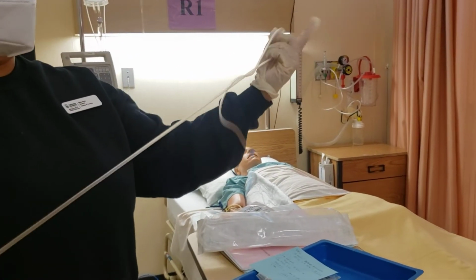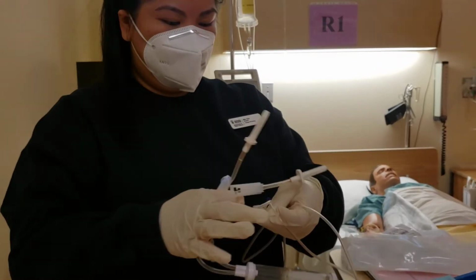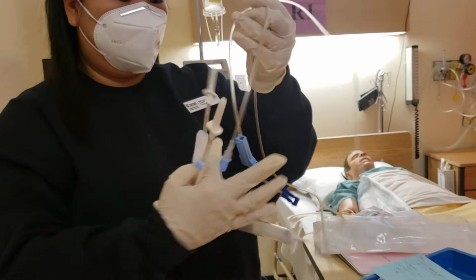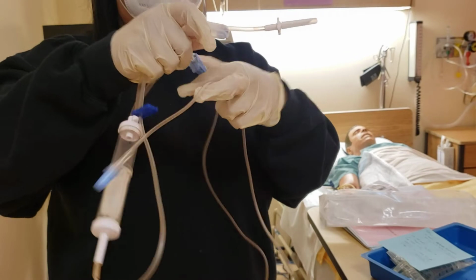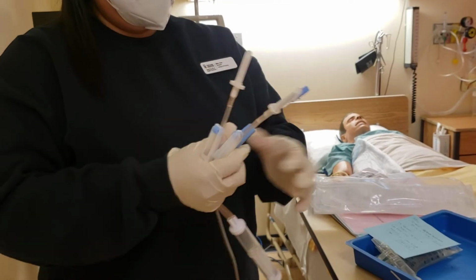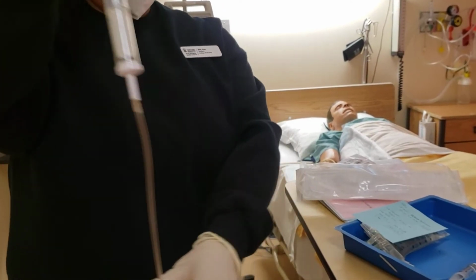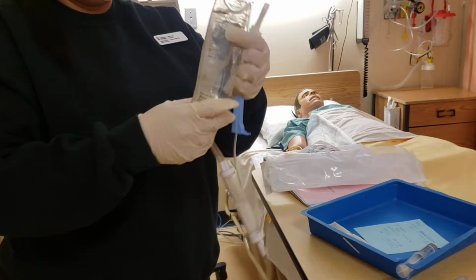So I will attach that to this syringe right here. Make sure that this is closed. After that, I can go ahead. I also made my final label here, which will go to our mini bag later after we inject the medication. On this med label, we just have the patient's name and the drug name.